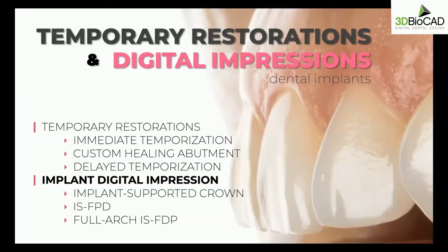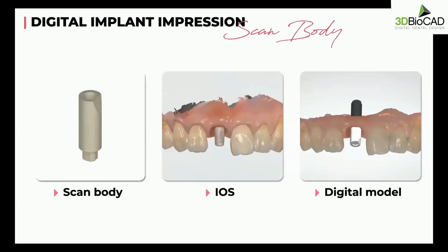Okay, so that's how I do my delayed temporary restorations. Now that we create a nice emergence profile, now we need to transfer that information to the lab. And traditionally, I used to do a traditional impression with impression copings and sent that to the lab. But now I switched over to doing everything digitally.